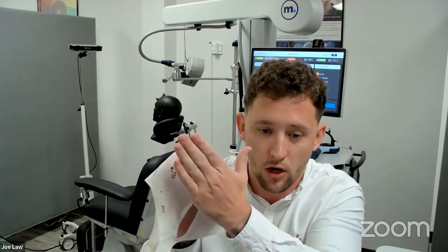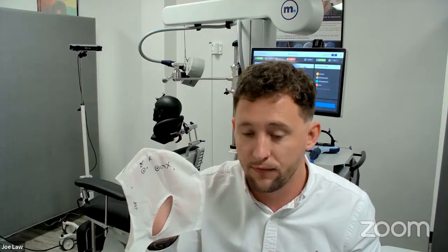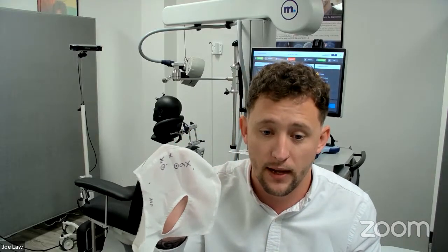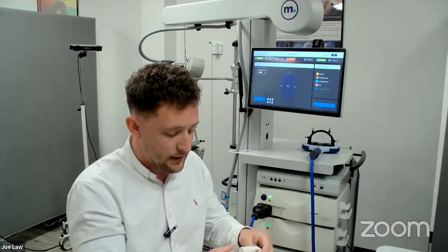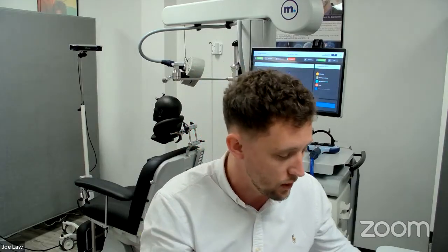Well, once you place the coil over those marks, it's difficult to see if that mark still remains in the same location of the coil. So these are the kind of things we tried combating when designing this system and the navigation system. So this system does not require caps. You do not need caps at all.